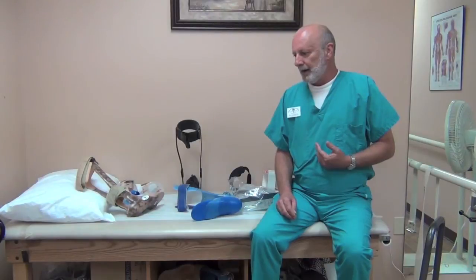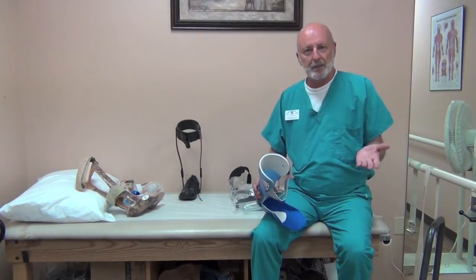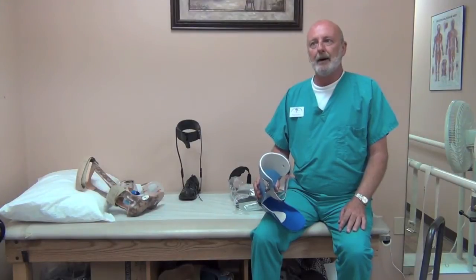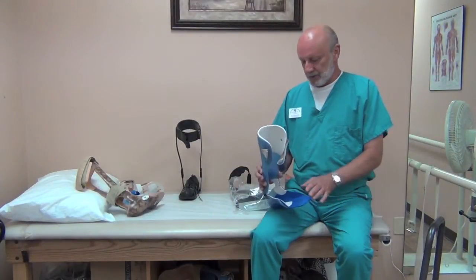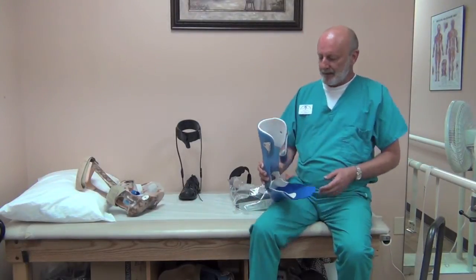This is a very treatable condition, although it does require the use of a brace if you don't use a functional electric stimulation device, which are typically not covered by insurance, though some are now. So today we're going to talk about bracing.